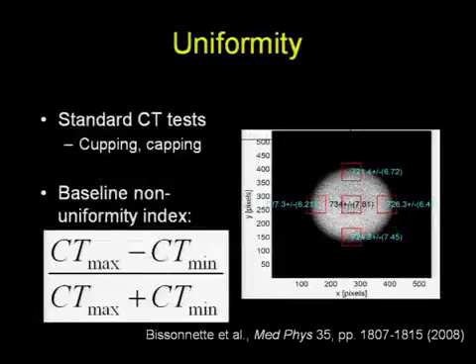Another thing that we look at is uniformity. Going to the uniformity section of your phantom, one can interrogate the images on the pixel values at the center and at the edges of the image, and compare the mean and standard deviation of all of these parameters.